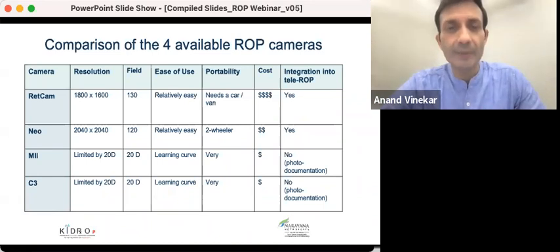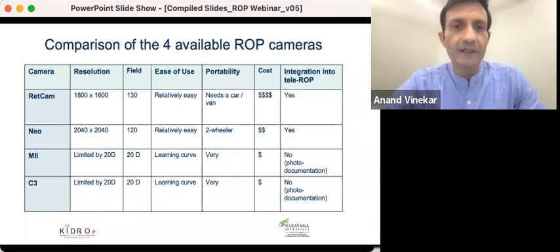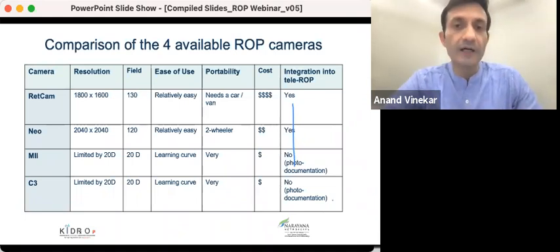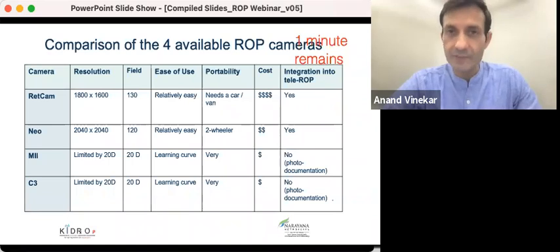The MII RetCam and the C3, again, are limited by the lens that you place at the end of the adapter, and of course the resolution of the phone, and therefore the field is also limited by that. Again, I would say there's a learning curve in the other two, because it's just like using a 20 diopter, only slightly more difficult now, because you have to place your hand on a baby, and then you have to move the working distance. So I've tried both. They are definitely usable. They're great for photo documentation, but there isn't any straight away integration with the telemedicine program, because that's really what we want, where these images directly come off the device and go into a telemedicine system.